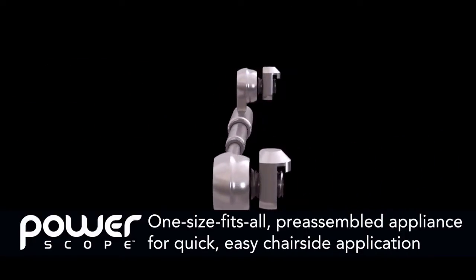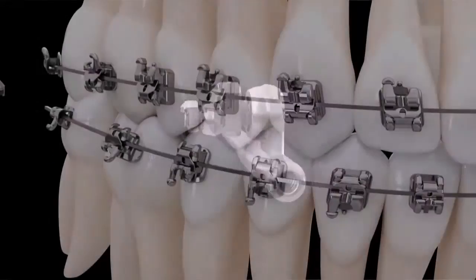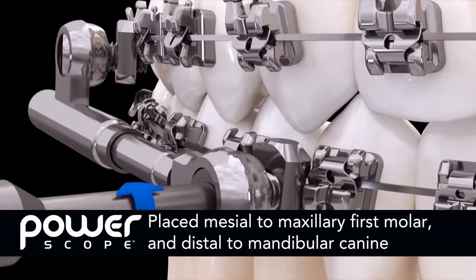PowerScope is a one-size-fits-all appliance, preassembled with attachment nuts for quick, easy chair-side application. The appliance goes on wire-to-wire and is placed mesial to the first molar in the maxillary arch and distal to the canine of the mandibular arch.